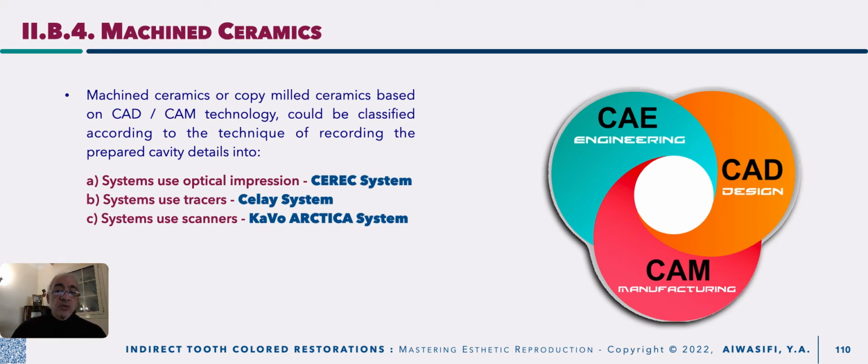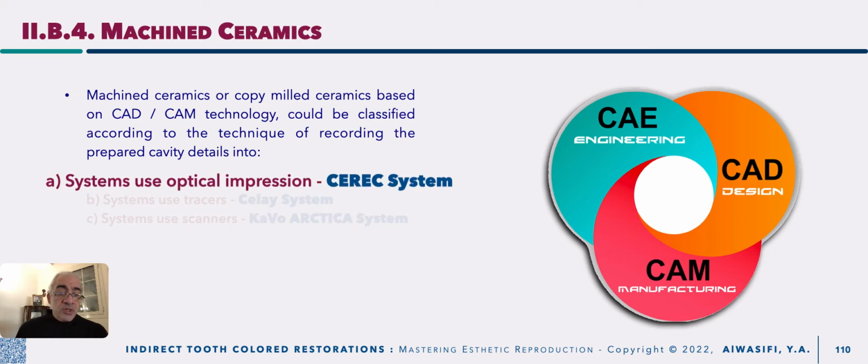Then comes one of the most recent, the CAD/CAM systems, as an example of using 3D scanners for the full details of your cast, your model, or your cavity. Then let us start with the system used for optical impression, which is CEREC.